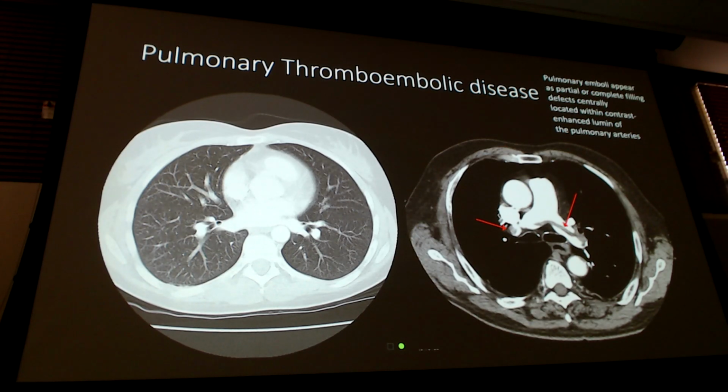And remember, if this wasn't a PE study, I could also use this to diagnose what? Think way back. Enlargement, stenosis. So, pulmonary arterial hypertension. Remember, if this pulmonary artery is wider than the aorta, it can be from the stenosis, like you were getting at. But for pulmonary arterial hypertension, this image is enough to diagnose that if I wanted to, or really just rule it out. That pulmonary artery is not clearly wider than my aorta. So they don't have that, but they do have this PE right here.